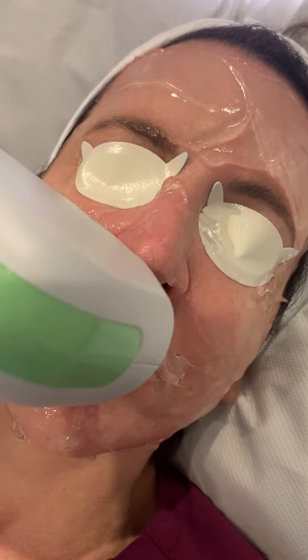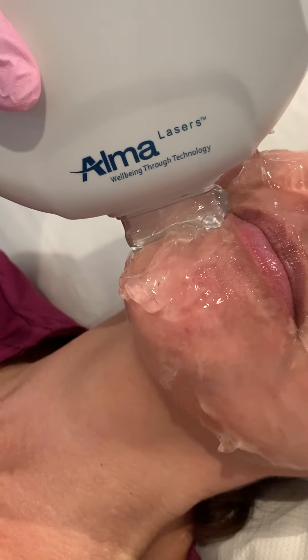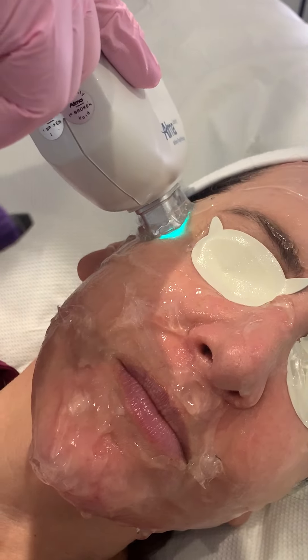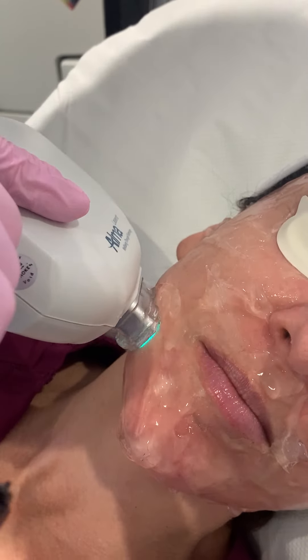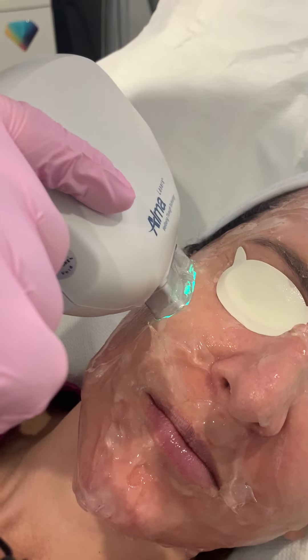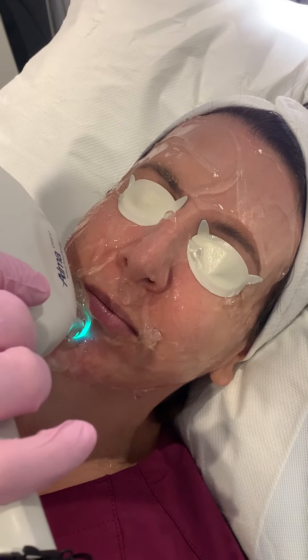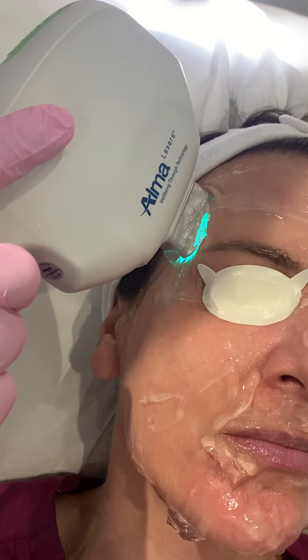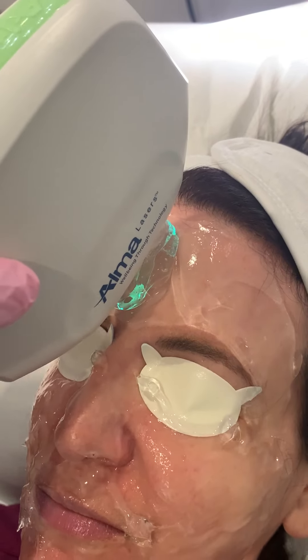And here we go — there's the oil on the lid. Always a little bit of a jump on that one. And then coming back, covering the opposite direction. Good. And then we're just going to come up the temple here and over the forehead. Be very careful not to catch the eyebrows.